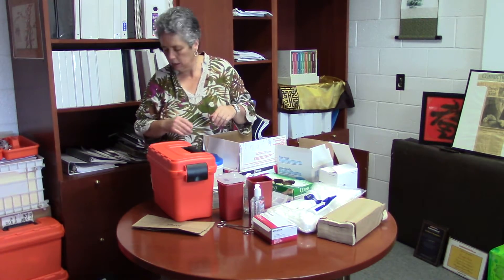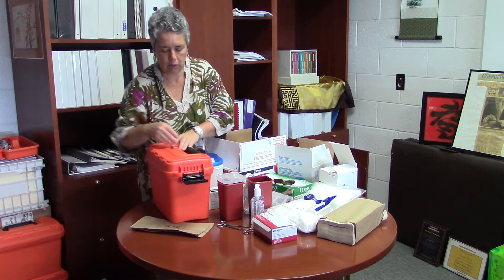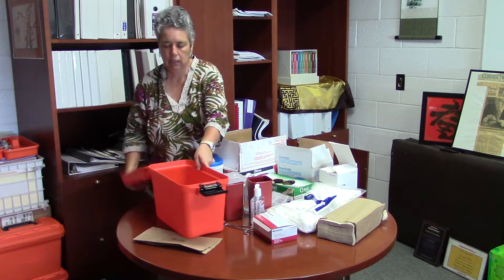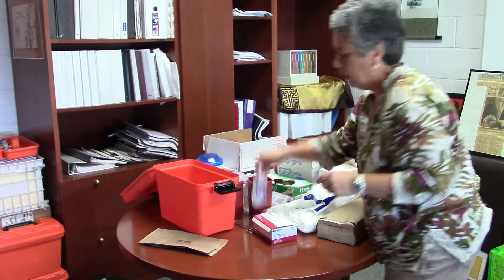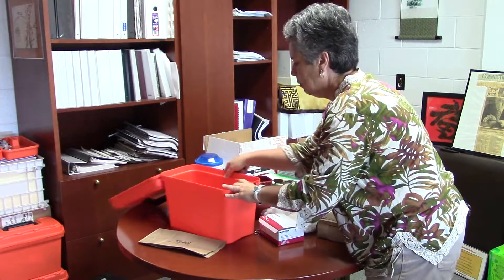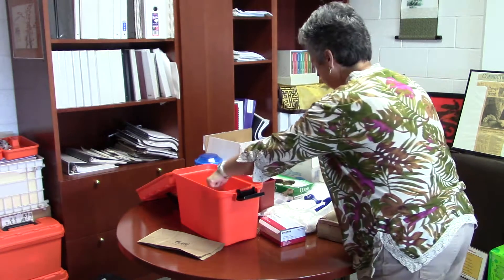My hands have been washed. My table is clean. I have all my supplies. I'm going to open my kit. Inside we're going to put the Purell — it does not need to be in a bag. And your hemostats or tweezers — they don't have to be hemostats, they can be tweezers.